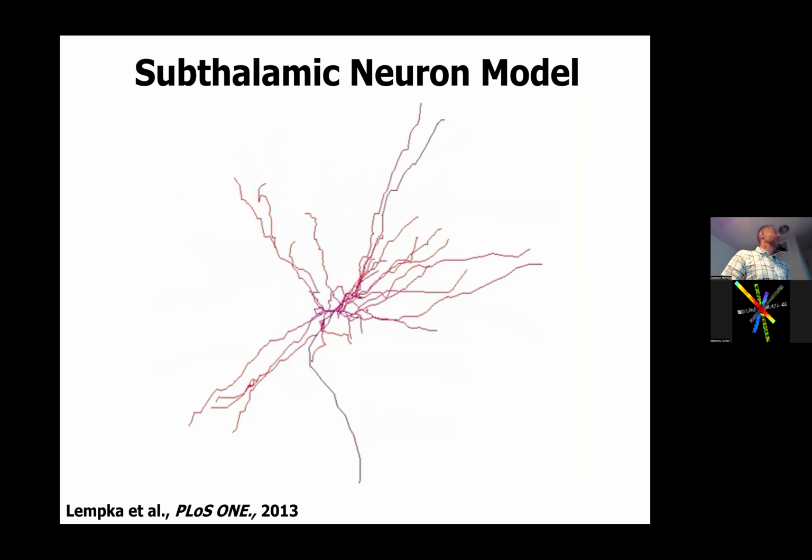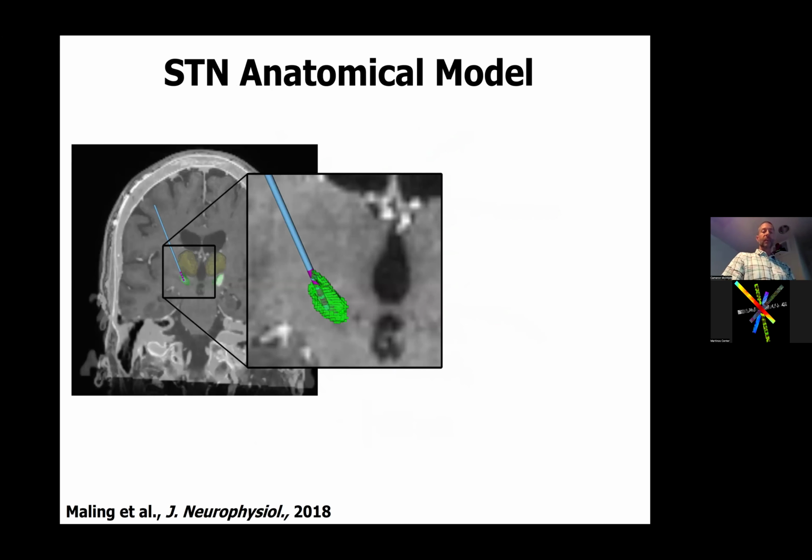big macro electrodes. So now if you've got an idea, or you've got a simulation that can give you an idea of where these currents are coming from, then we can start to think about putting that in the context of an individual patient brain.